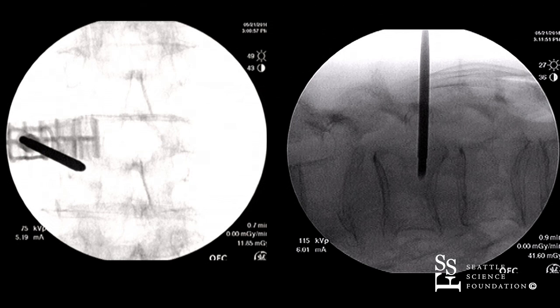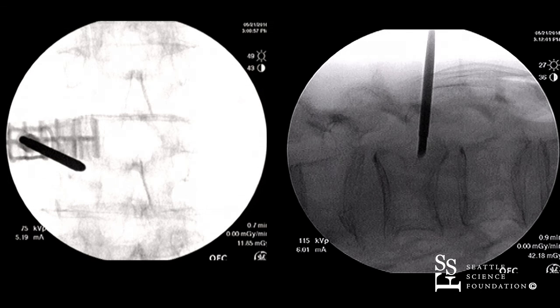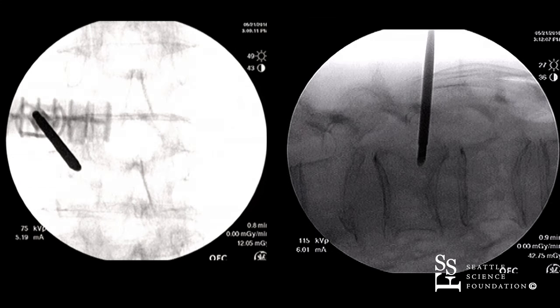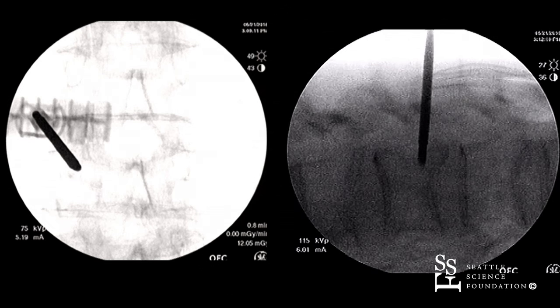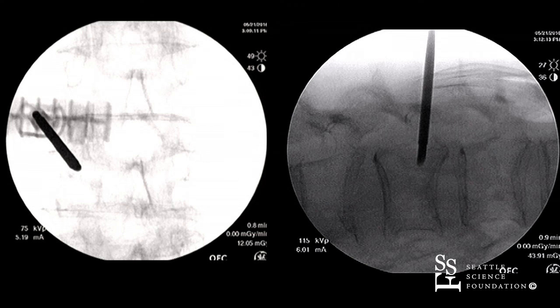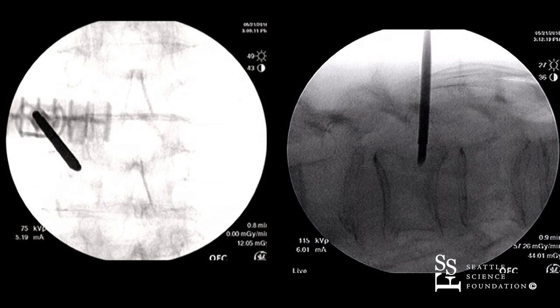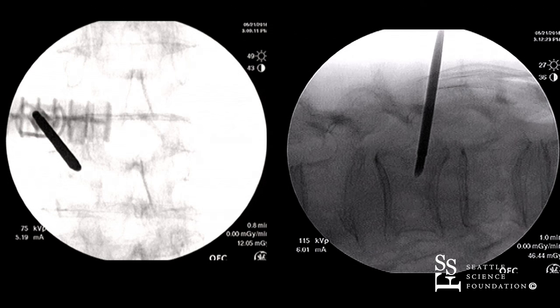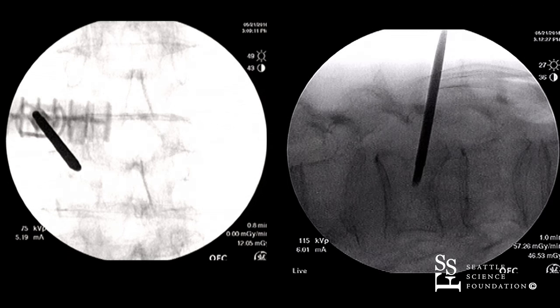A little better trajectory here — now allowing it to dive a little bit more inferiorly there.